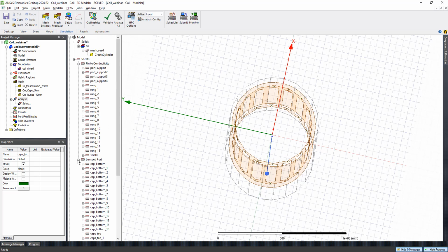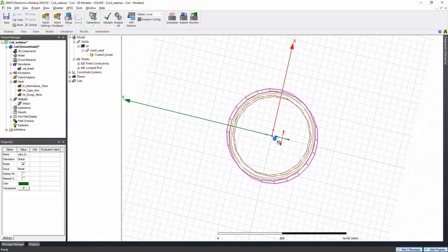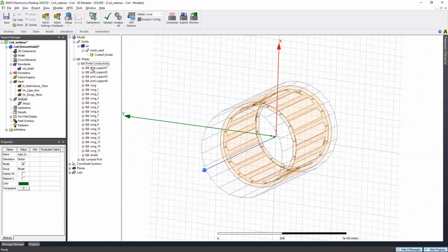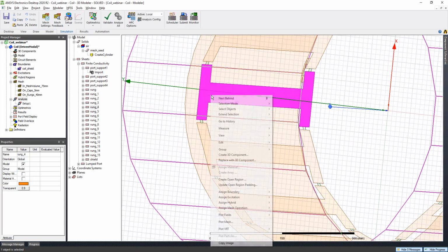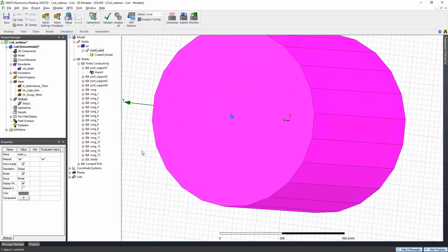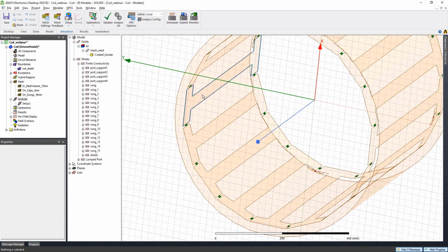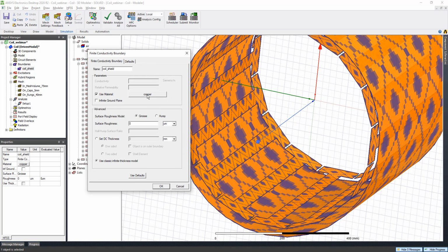The next thing is we need to set up the material properties and the excitation ports. I'm making everything simple here, so we are using sheets. This is a 2D object, so there's no thickness in this case. But if you import your object, you are always welcome to assign a material to that. In this case we don't have it. I have these coils with a finite conductivity for the material properties, so I'm using copper for it.